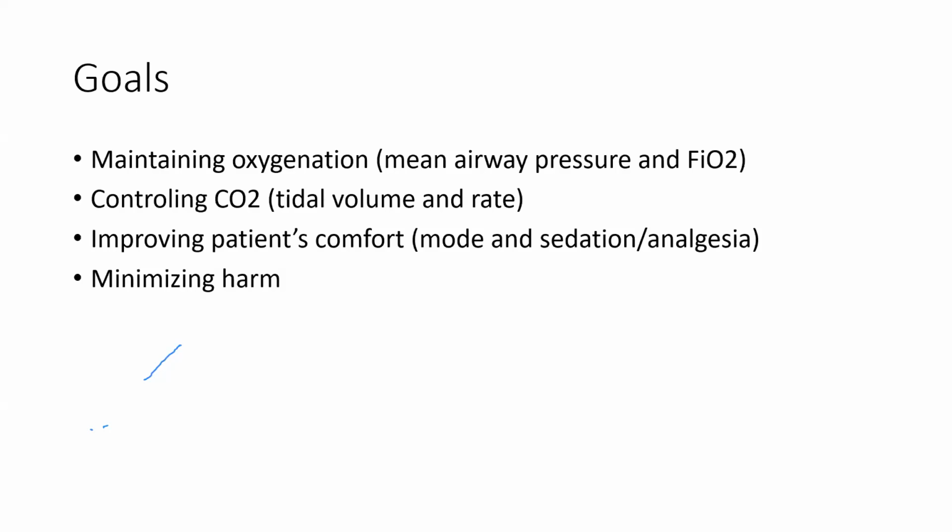the CO2 and improve the pH. These are the two main goals, but while doing this, you need to ensure the patient's comfort, and this can be achieved by careful selection of the mode and by the wise usage of sedation and or analgesia. And while doing this, you need to always keep in mind that minimizing harm is a very important goal in mechanical ventilation, because we said it is harmful, so you want to minimize harm. These are the goals.